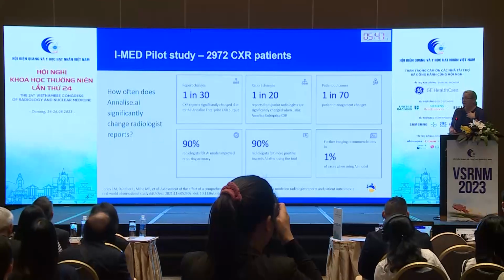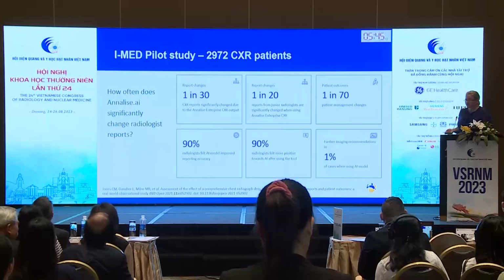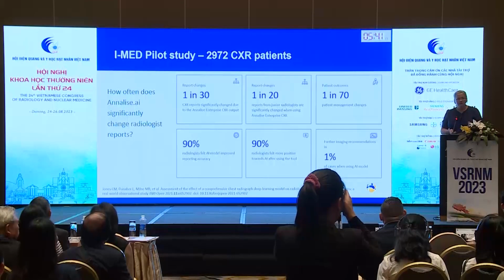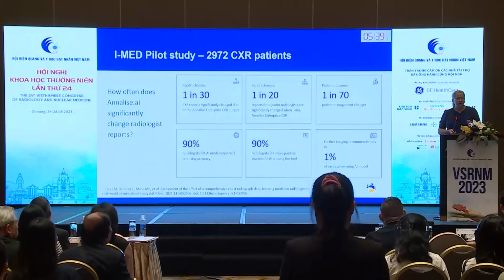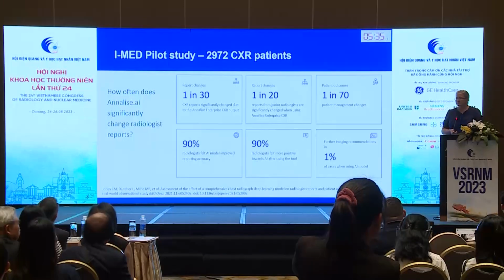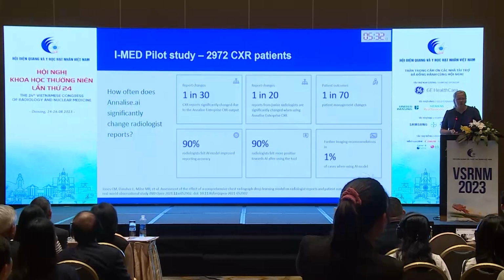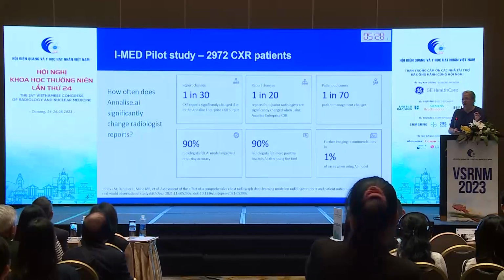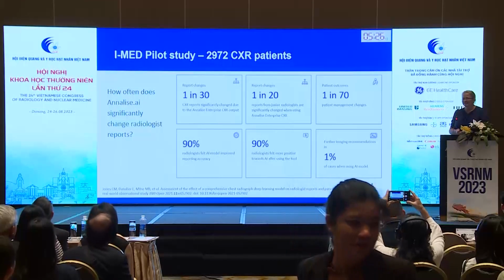And I ran this as a research study with ethics approval. And one of the questions was, did this change your report? And the radiologists answered this question for every single case. Did this really change your report? And the answer was, for about 3.5% of the time, it did.